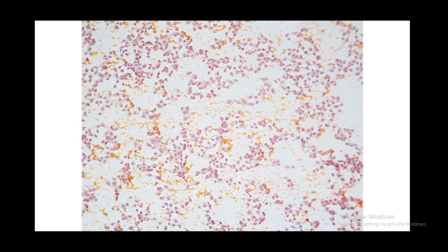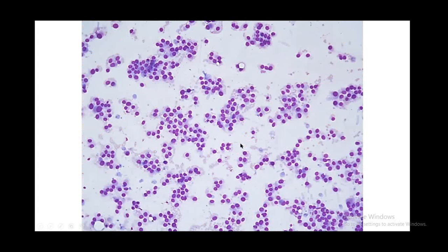The FNAC from this thyroid tumor was very cellular, and the aspirates showed singly scattered cells, which were atypical, and there were no clusters, no papillae were identified. The cells at low magnification also appeared plasmacytoid in appearance. There was some multinucleation, which was identifiable.